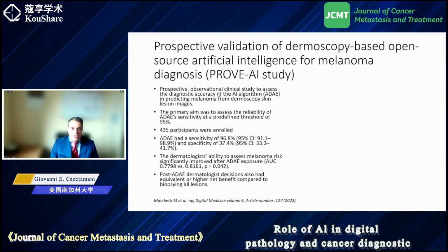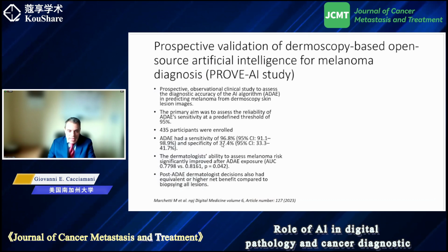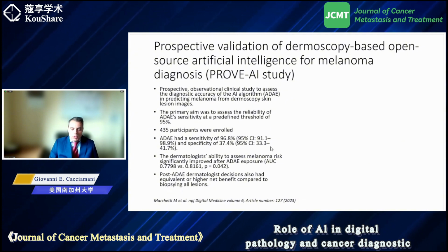This is a large study enrolling more than 400 patients, and the system based on digital image analysis showed a sensitivity of 97%, but a specificity of only 37% for melanoma, because it was still confounding different tumors. But in this regard, of course, humans could then place their own diagnosis, so that overall the ability of doctors was increased in a significant manner when digital images were added to the conventional routine. So once again, not substituting, but offering an additional tool to doctors.